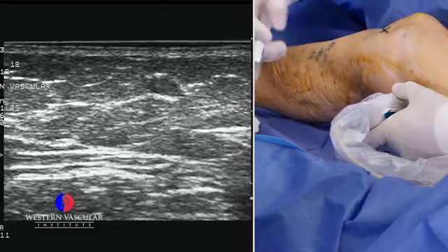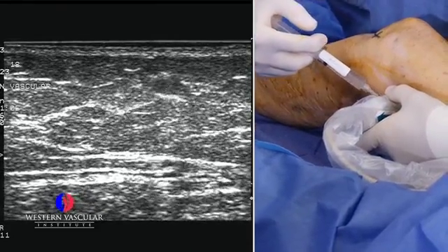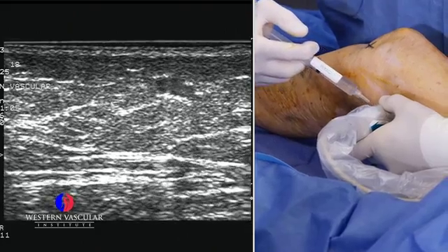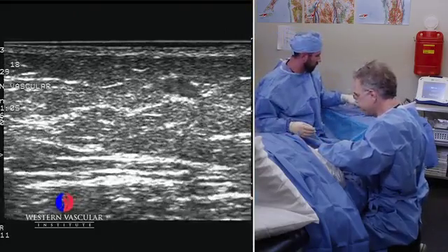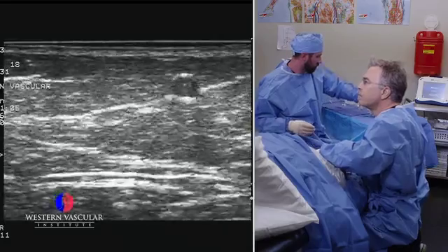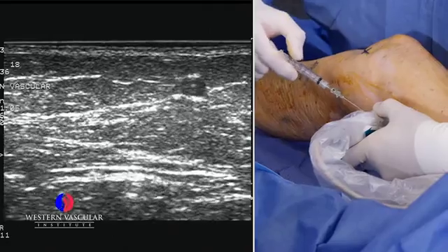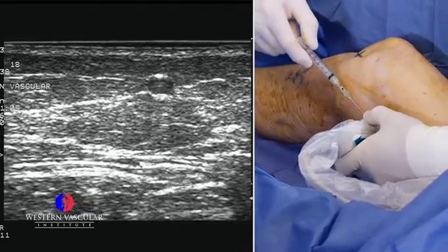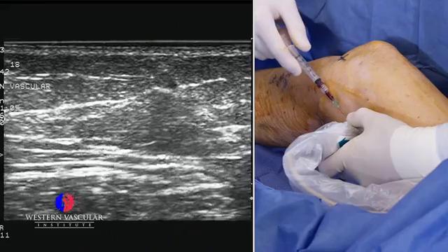We're going to just locally numb up the skin a little bit here with some novocaine. Then we're going to get an access needle to gain entry into the vein, which we did.